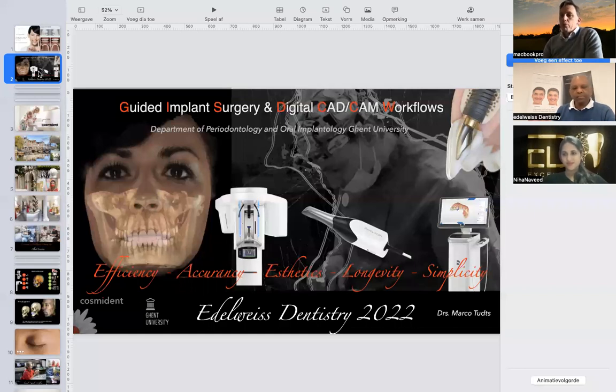Most people in the world say they can do immediate loading, but everyone is doing it with a temporary crown, because they say you have to put a temporary crown and put it out of occlusion. We developed a system where you can go with a definitive crown. In the case of Tatiana, we used the Edelweiss block. I don't want to use zirconium crowns in this kind of case, because then you get overocclusion and you lose your implant. So I use both indeed.